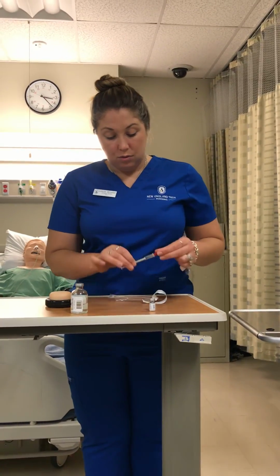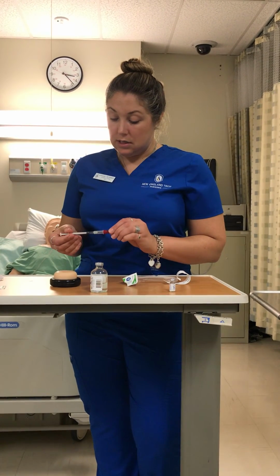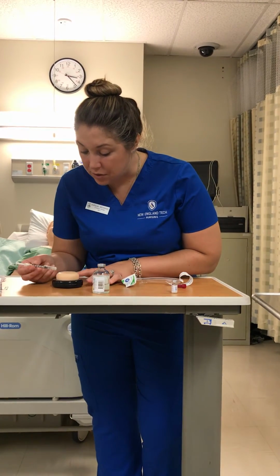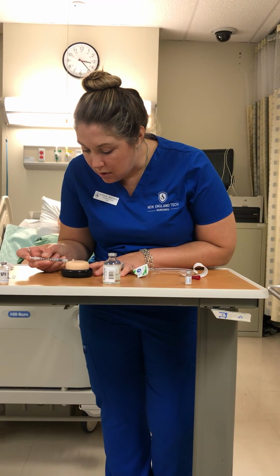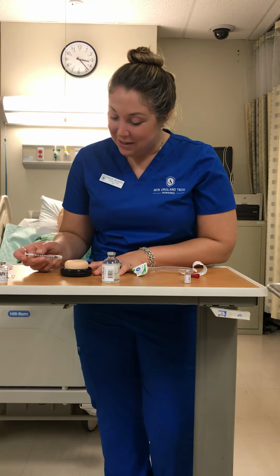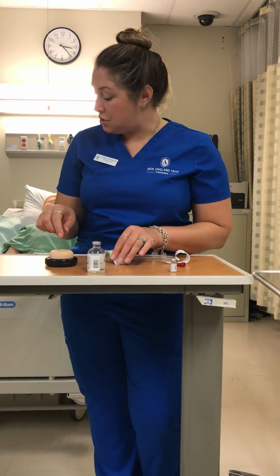You want to make sure that you prep the skin, starting on the inner, cleaning to the outer in a circular pattern. Take the cap off. And this one you're going to want to administer at a 5 to 15 degree angle, right under the first layer. And as you do it, you're going to want to see the bubble underneath the skin. Normal skin won't do that. Administer the medication right underneath the skin. This special needle has a safety device that will go right into the sharps container. When you administer the TB testing, you want to make sure that you circle the area.